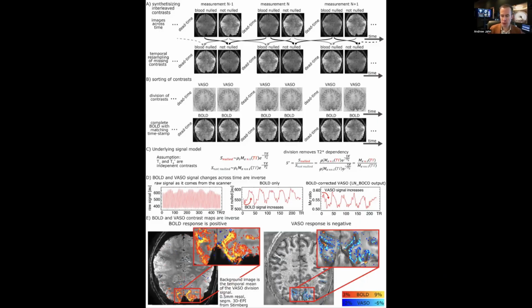Just the way that it's set up, it's trying to remove some of these BOLD effects as though they were contamination almost of underlying tissue activity. You can see there's a pretty strong anti-correlation between the BOLD signal and also the VASO signal variability. So you don't see as wide a spread of these activation maps or deactivation maps as the case may be, but it does seem to be a lot more spatially specific and probably controls better for false positives. So this is one of the choices you have when analyzing layer-specific fMRI data.